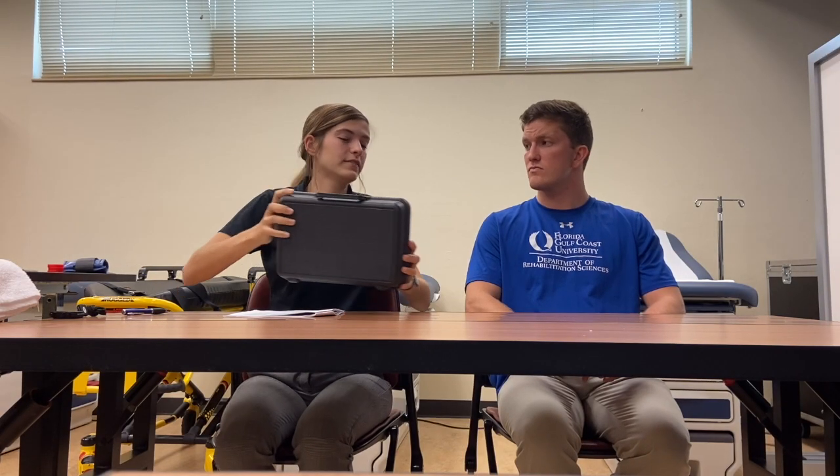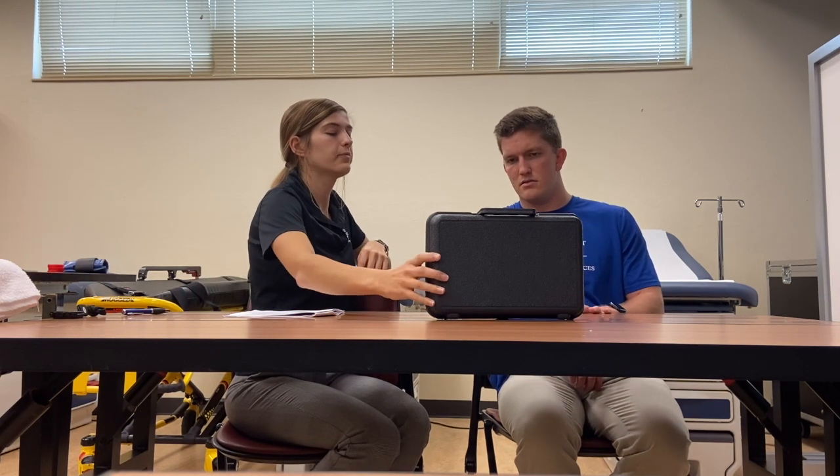For task 15 we're going to go ahead and use this wall and this key. You're going to grasp the key between your thumb and forefinger and you are going to place the key into the lock and turn it left as far as it can go and then right as far as it can go and then you will bring it back up to the vertical position. There is a stop on either side and be sure to move the key until you reach that point. Do you have any questions? I do not. Ready, set, go.